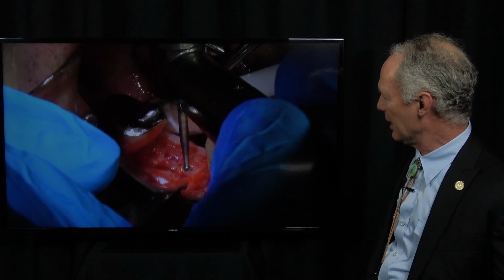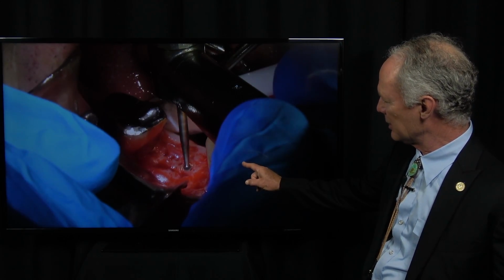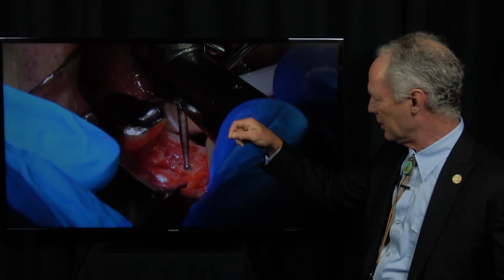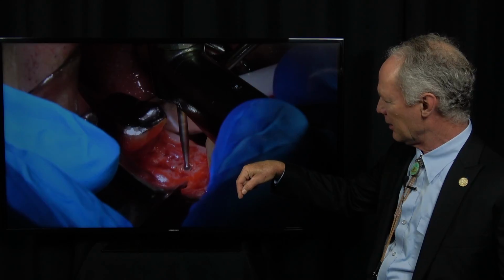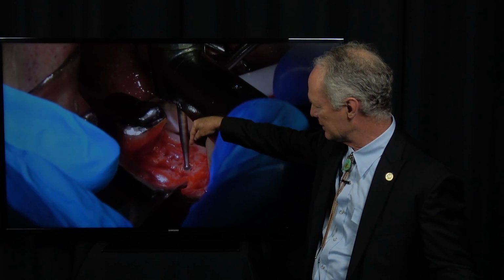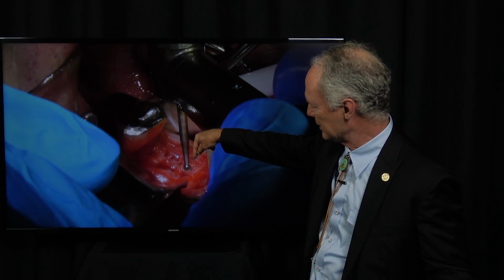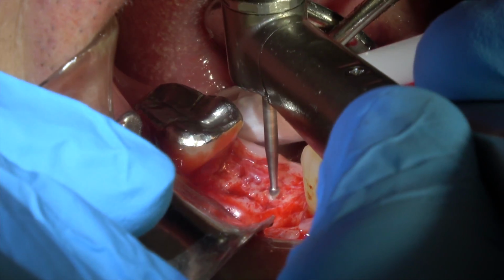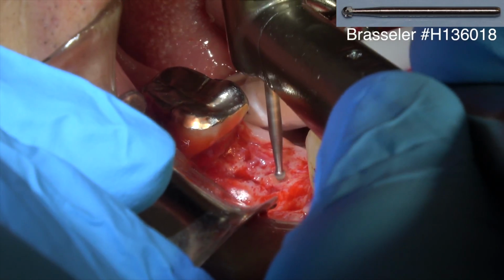So that's perfect. Now I'm using this long shank round burr to make a little divot which will hold my pilot drill, and also let me look at the occlusal surface to be sure I'm exactly where I want to be placing that implant. Now you'll notice I don't have a cone beam radiograph. I'm going to show you another technique that's very, very specific, but you don't have to use a cone beam. We're going to use a pilot drill. I'm just creating that little divot, and then I'm going to look at it and be sure it's in the right spot.